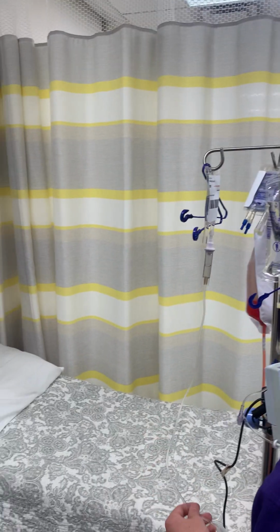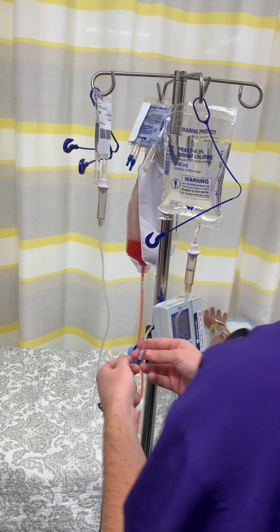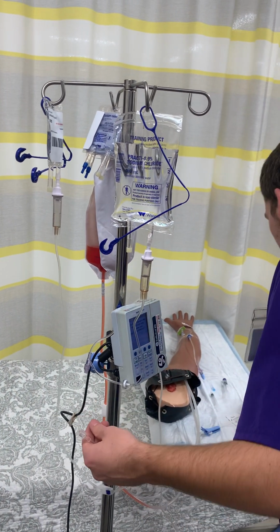And we're going to now plug this in here. We haven't pushed start yet.